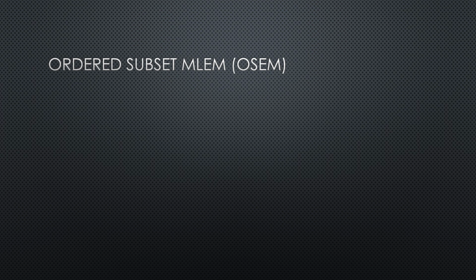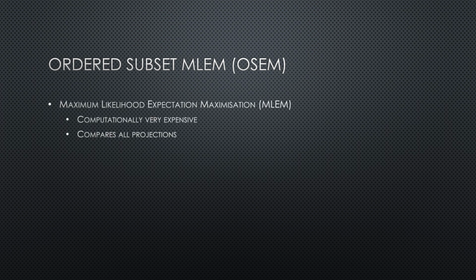Of course, we rarely use MLEM reconstruction and instead use OSEM or ordered subset MLEM instead. This is because maximum likelihood expectation maximization is computationally really expensive, because what we're doing at each iteration is comparing all the projections from our estimate to all the projections in the acquired data. And that takes a lot of computational energy.